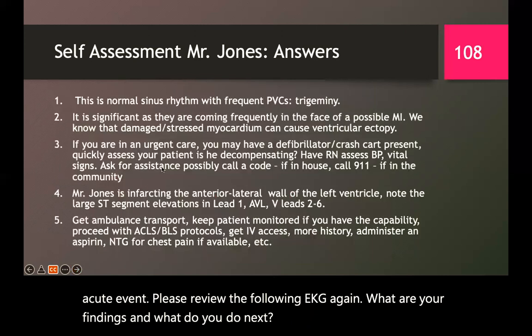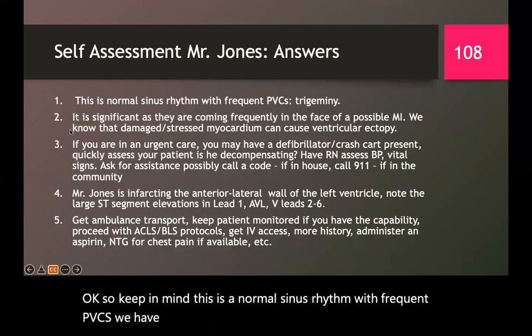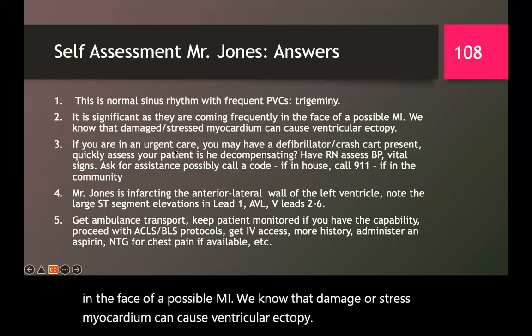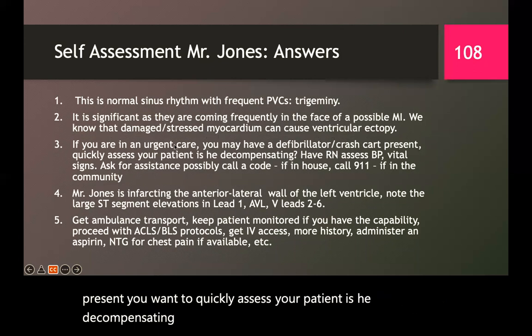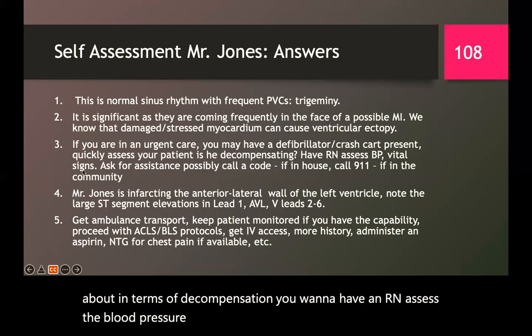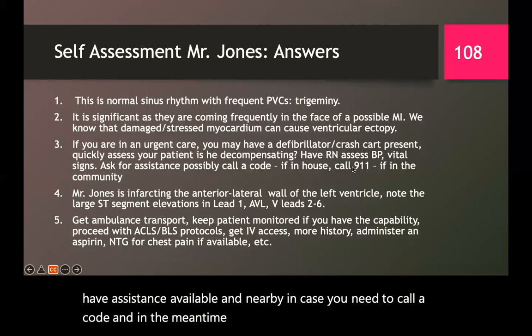Okay, so keep in mind, this is a normal sinus rhythm with frequent PVCs. We have trigeminy. It is significant as they are coming frequently in the face of a possible MI. We know that damaged or stressed myocardium can cause ventricular ectopy. If you're in an urgent care, you may have a defibrillator crash cart present. You want to quickly assess your patient. Is he decompensating? Remember those clinical symptoms we talk about in terms of decompensation. You want to have an RN assess the blood pressure, get your vitals, get an IV going, make sure you have assistance available and nearby in case you need to call a code. And in the meantime, have somebody call 911 if you're in the community.